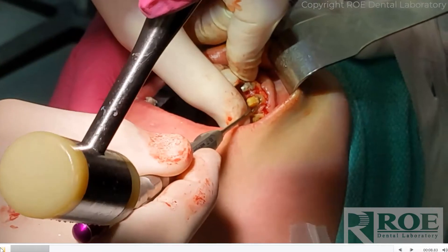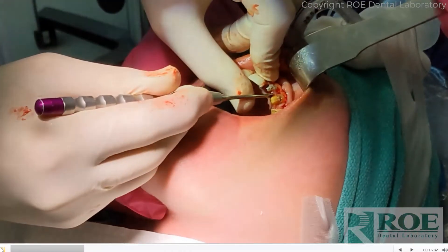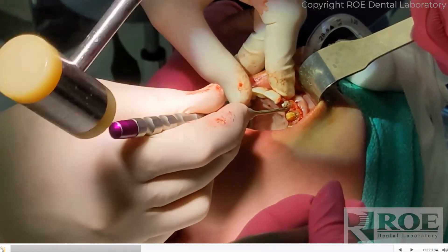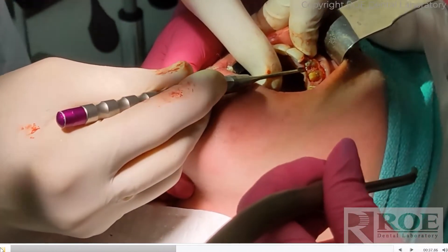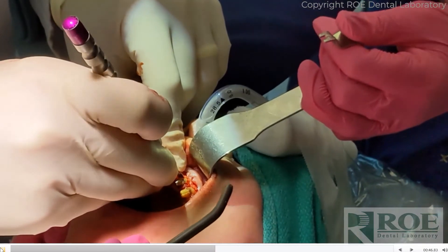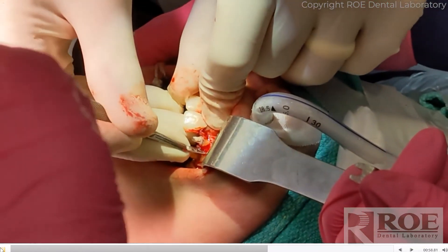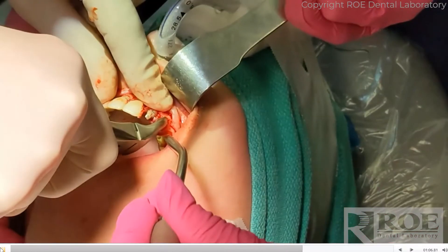On a Chrome Natural, it is of utmost importance that the buccal plate and the bone are preserved around the teeth. Yes, there will be some adjustment for the prosthetic, but that's mostly to widen it and to adjust for interproximal and interdental bone. The teeth must come out atraumatically, because if you lose the buccal plate then FP1 is not going to go as smoothly restoratively or surgically. The doctor spent about an hour carefully removing every tooth and every root — quite a tedious job. They're just tapping around the root trying to break the roots free.